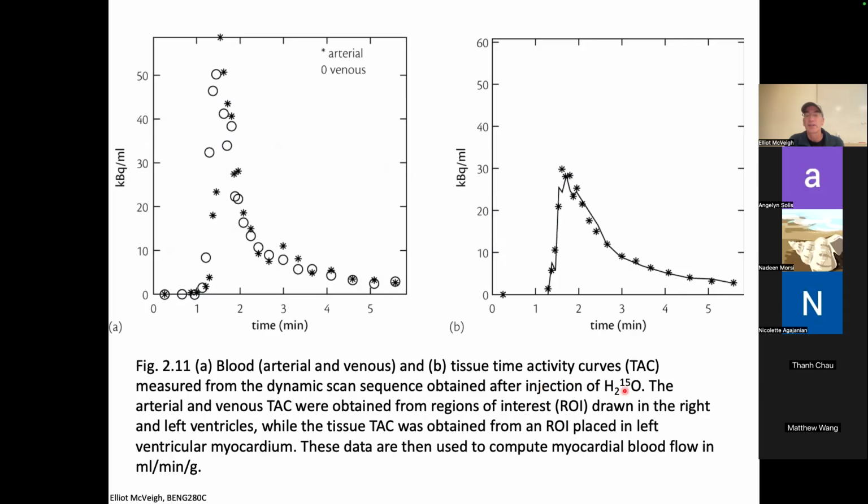And that's because this stuff has such a short half-life, right? So two things are happening. It's flowing in, flowing out, going to the kidneys, but it's also losing its radioactivity really quickly. Okay. But so this gives you a really sharp input function.